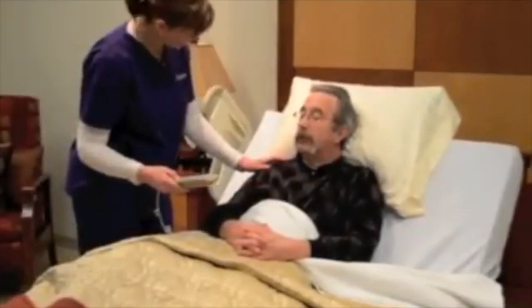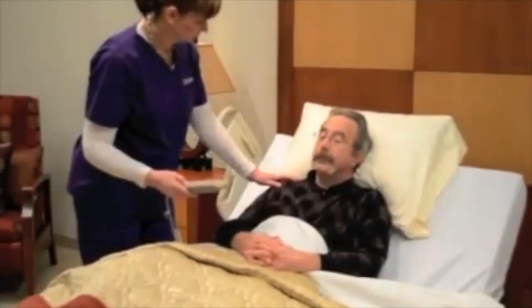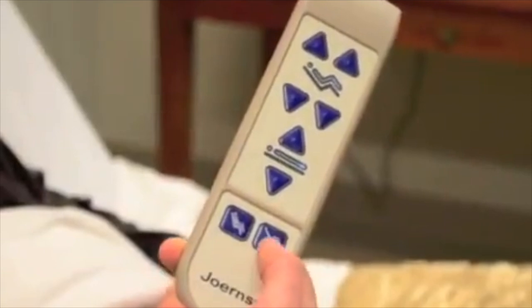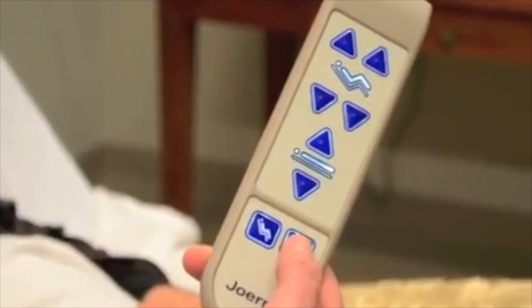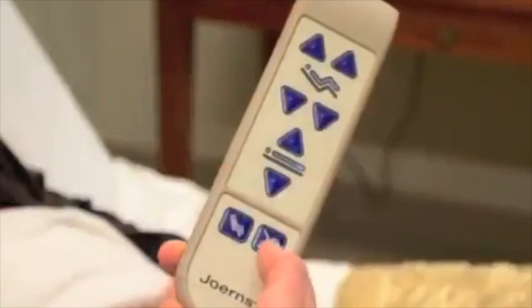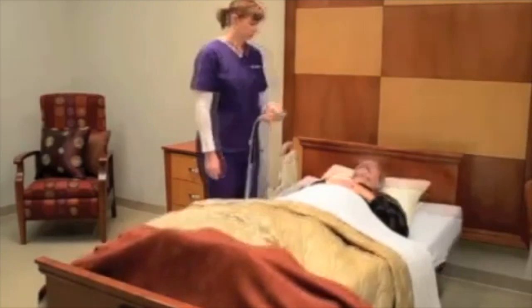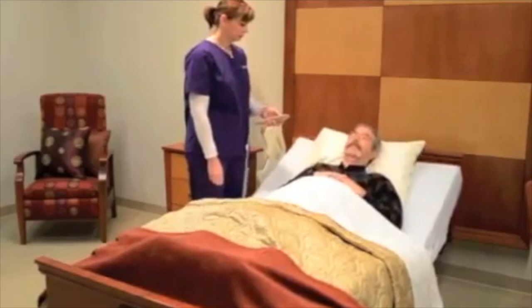Another feature of advanced care is auto transfer, which raises or lowers the bed to a safe transfer height. When transferring a resident in or out of bed, simply hold down the auto transfer button, which is located on the lower right side of the pendant. Before transferring residents in or out of bed, caregivers should raise the knee section of the bed first, then raise the head section of the bed. This will minimize residents from sliding down in bed.